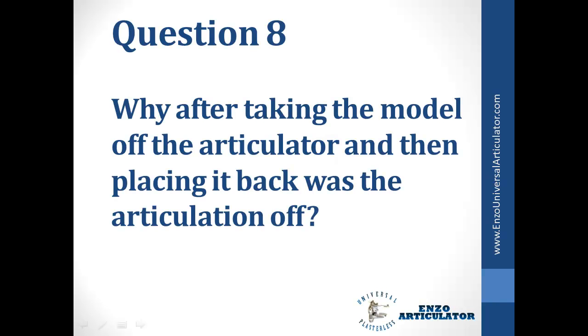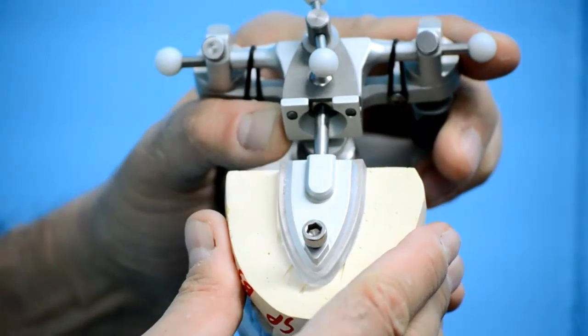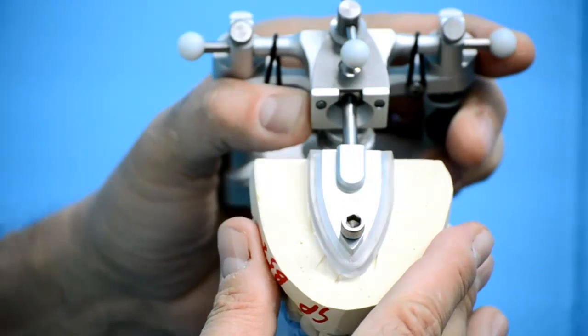Why, after taking the model off the articulator and then placing it back, was the articulation off? Before articulating the model, make sure the plastic female and male are engaged all the way and the top screw is tight.